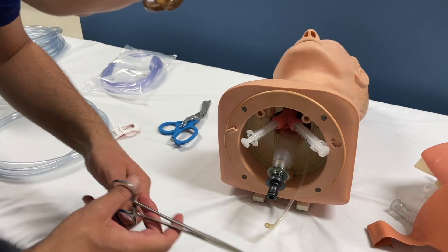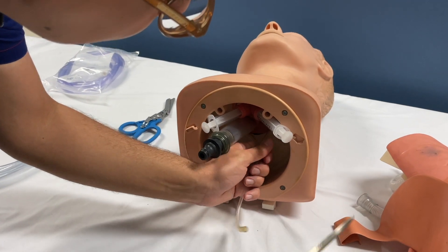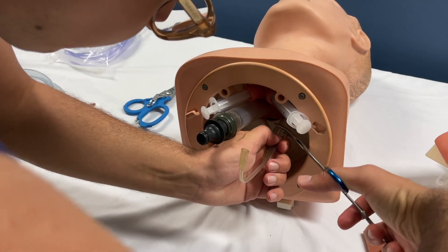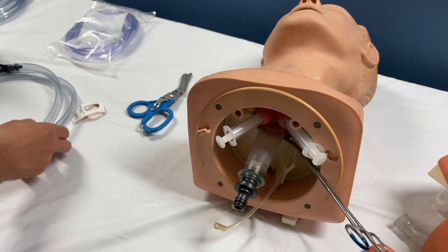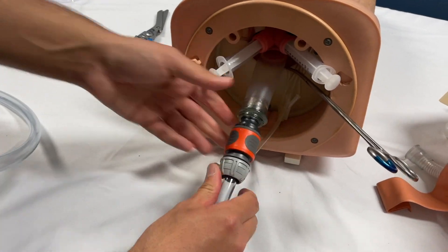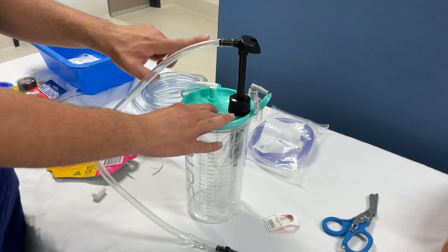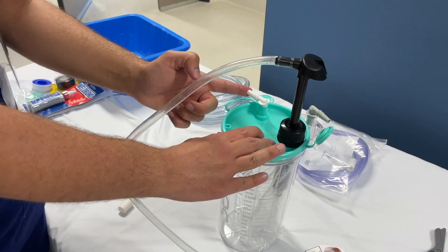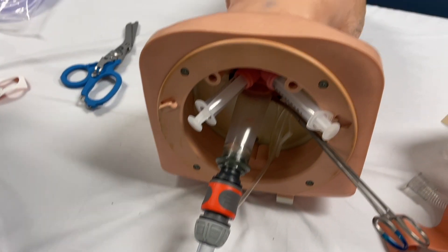Now we need some forceps and we can just take all these small tubings here and clamp them off, because there might be some water otherwise running out of them. And now we can already connect our esophagus to our pump. We would now connect the suction unit to that port over here, and we connect our DuCanto catheter to that port. And then we can pump the water into the circuit.